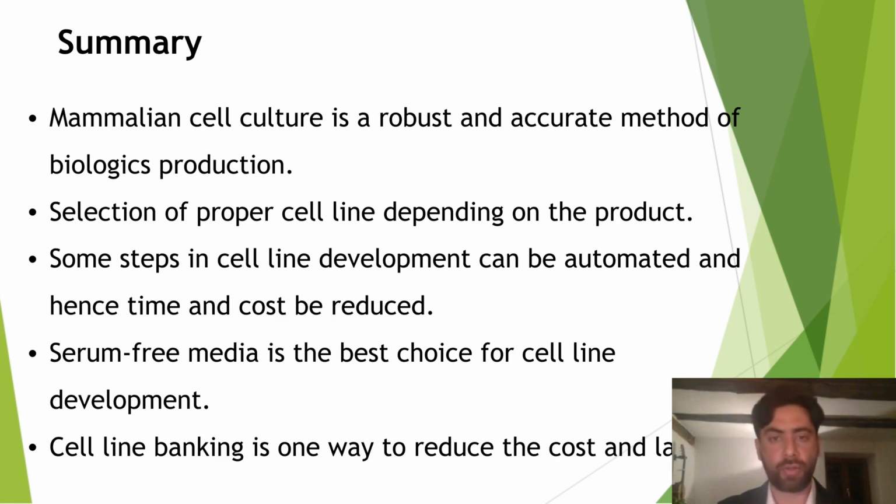Serum-free media, I showed you that it is one of the most promising methods to actually produce your biologics. And that is in any way the best choice for cell line development as well, because you should be taking into consideration the ethical reasons for the FBS use as well. FBS is anyways produced from fetal calf serum, which comes from live animals in the third trimester of pregnancy. So yeah, ethically, it is not a good idea to use the FBS in such a large amount.